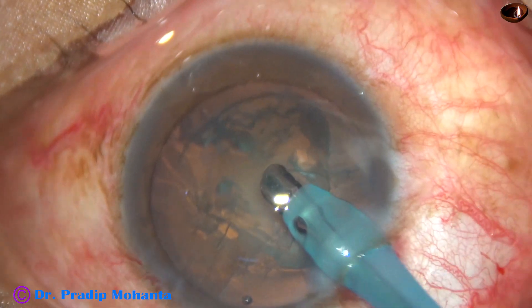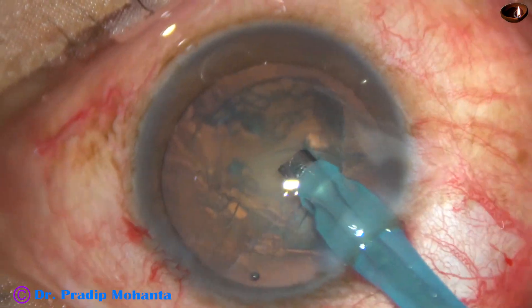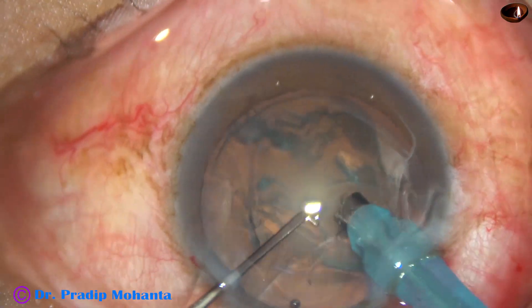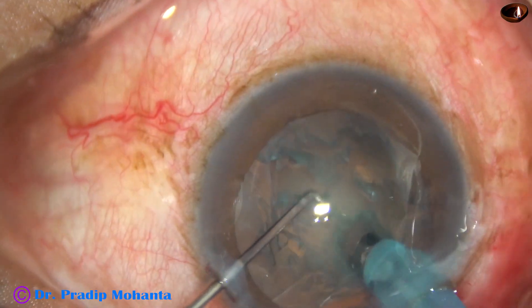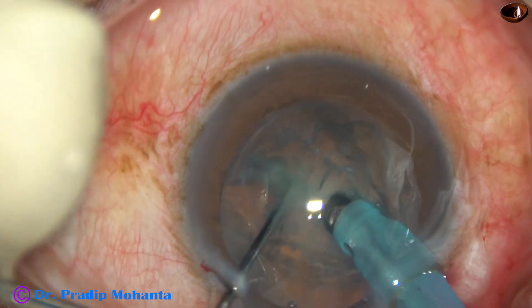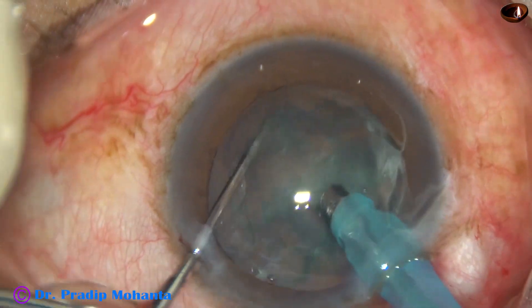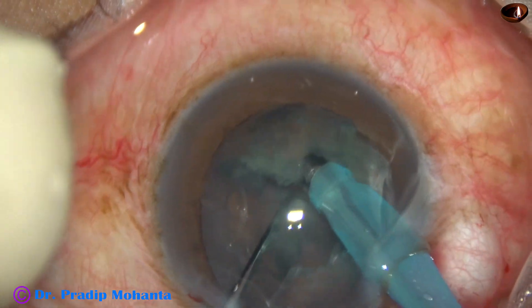Now the handpiece is turned, bevel is up, and a very small pit is made just in front of the main incision so that we can support the lens mass in front by the FACO needle. The FACO needle is remaining at irrigation — no vacuum is being used.